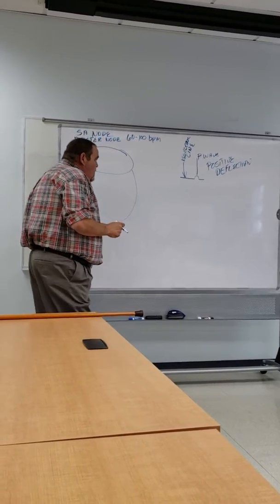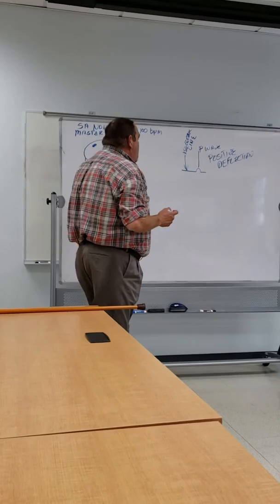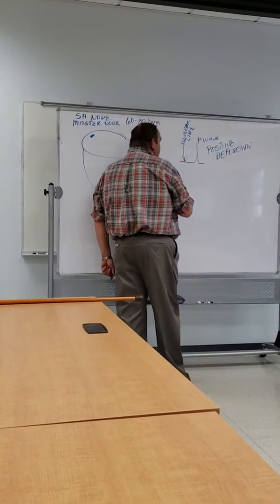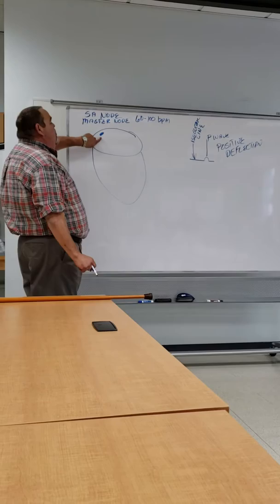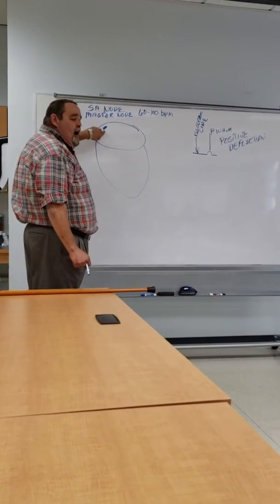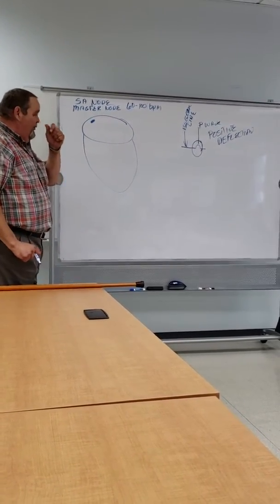Now, we're going to have to put all this together in a minute, so pay close attention. That P wave is a positive deflection off the isoelectric line. Now, that represents when this SA node fires. That is represented on the EKG strip as the P wave.